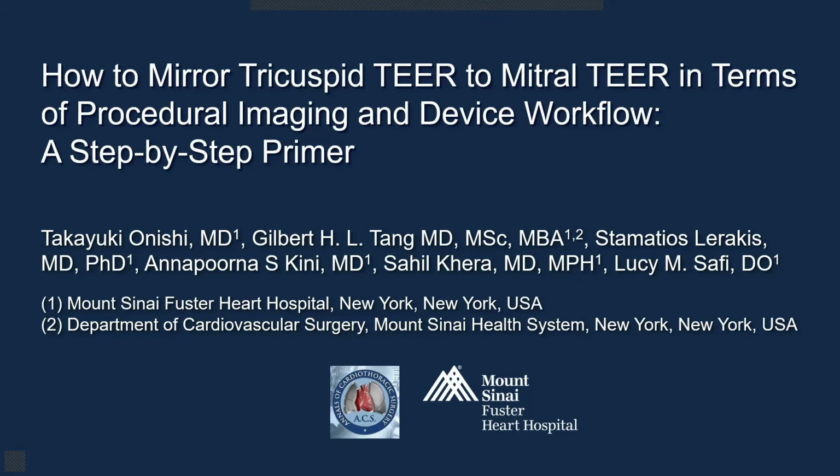Hello. Today, my lecture is for the Annals of Cardiothoracic Surgery, and on behalf of my co-authors, we're going to talk about how to mirror tricuspid TEER to mitral TEER in terms of procedural imaging and device workflow, a step-by-step primer.